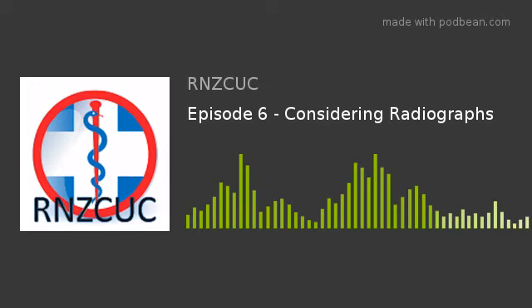And so often, this will be something that I'll push back against, saying clinically, I am very concerned about a Lisfranc injury, and I suggest you review it acutely. If it's reasonably swollen, but I'm not as clinically worried, I will always try to get follow-up orthopedically, because ideally a CT or an MRI is a much better imaging modality.